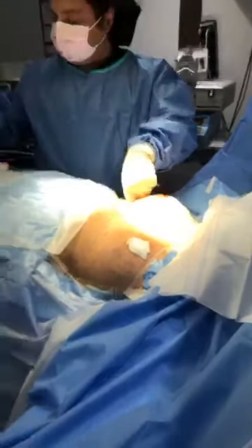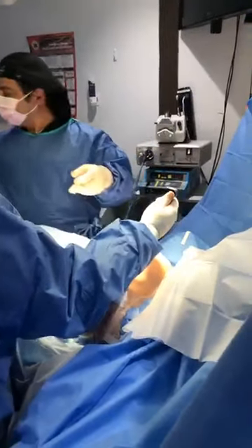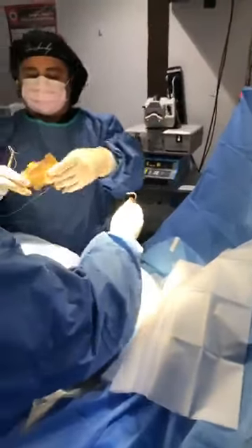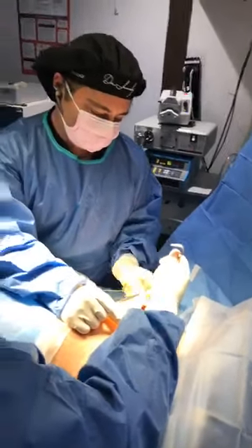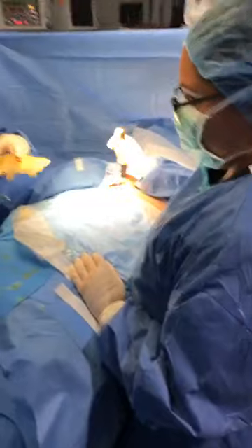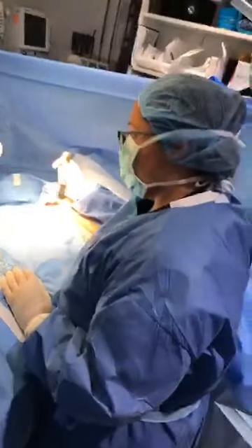We're also going to note the implant. When you feel it, it feels like a mesh — a wiry sort of mesh. You're going to put this in like this; you want it to seat back.